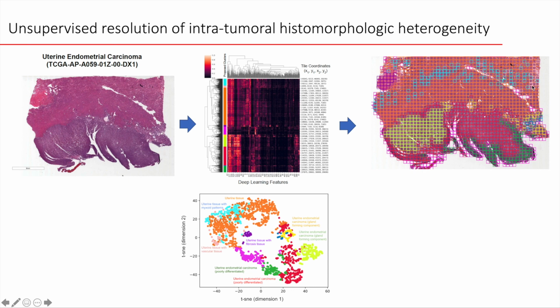subgroup. There seems to be some artifact or some myxoid material in the middle area of the endometrial carcinoma, and then of the endometrial tissue. And then you can see the carcinoma. There's three major colors. There is this lime color, there is this red color on this fragment, and then green color here.